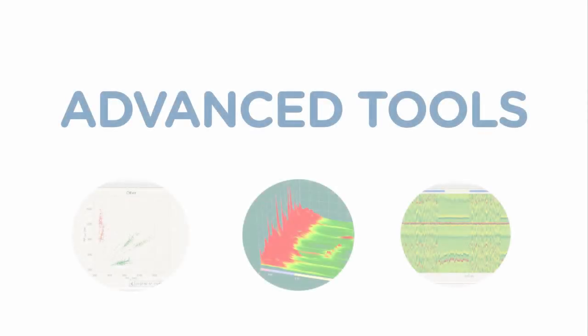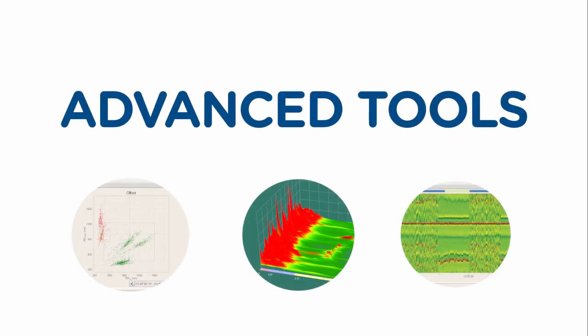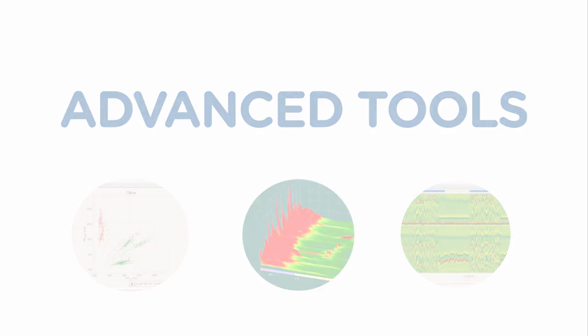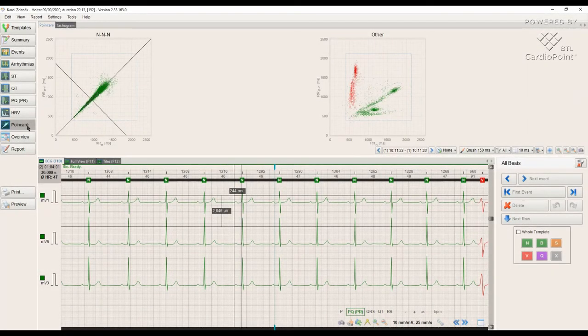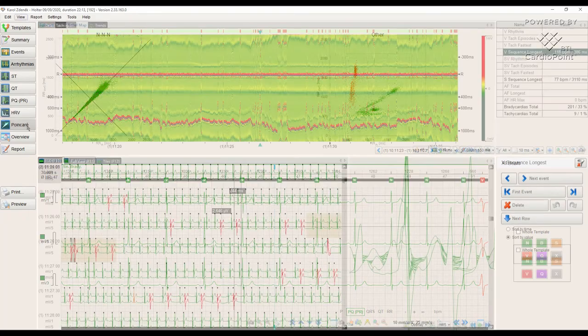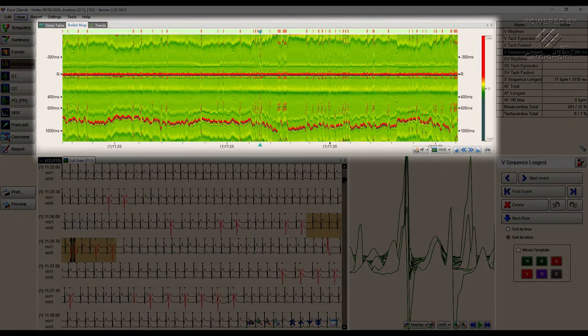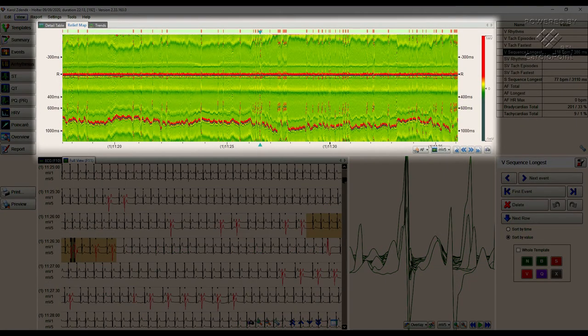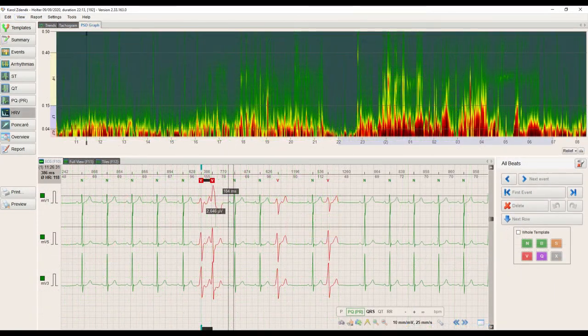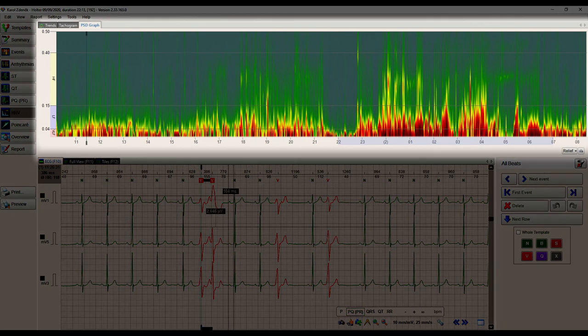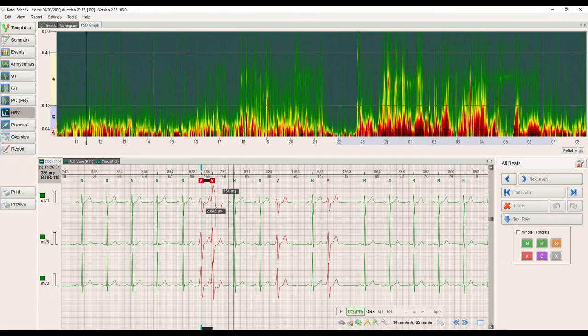Advanced tools of BTL CardioPoint Holter such as Poincaré, ReliefMap and PSD Graph offer various visual analysis methods that increase diagnostic confidence and speed up the work, making Holter examinations much easier. We will take a closer look at them in the following videos.